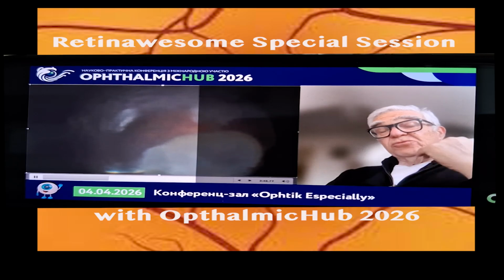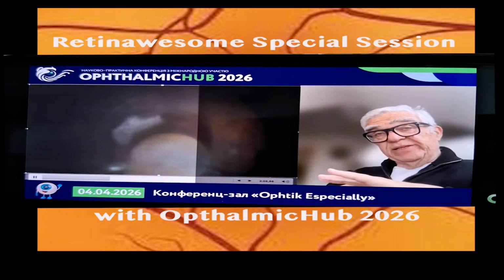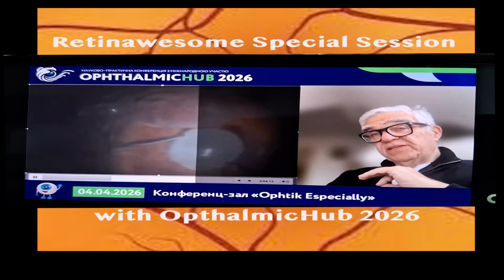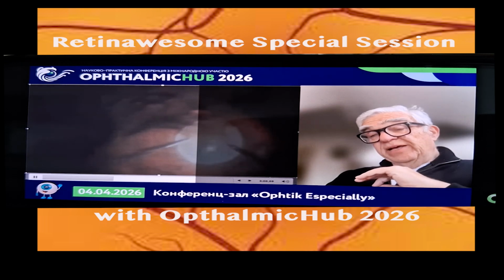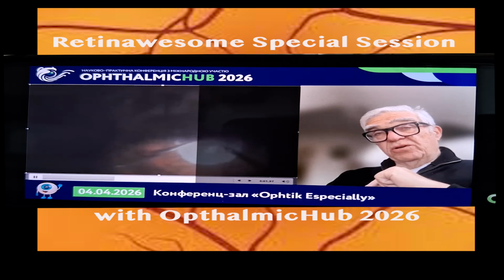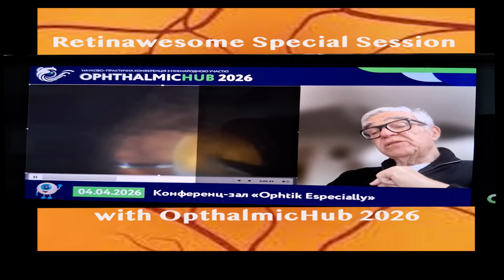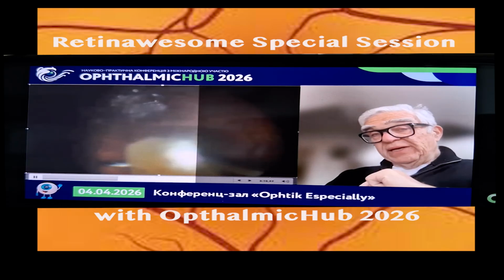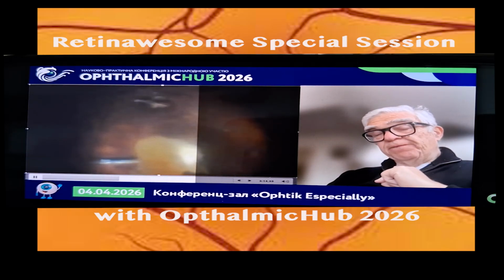I never remove anything that's sitting on the retina. If it's sitting on the retina, it's got to be lifted, and all the vitreous has to be removed before you start cutting the nucleus. As you can see, the rotation of the nucleus inside the eye means that you already removed all the vitreous around it. And then whatever you do is in the middle of the eye. You should not touch anything.